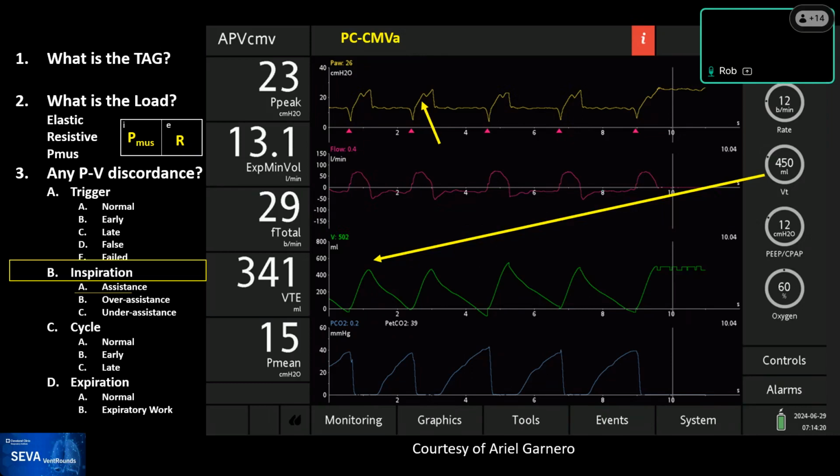And in pressure control, auto peep just decreases the tidal volume and doesn't necessarily affect the plateau pressure, depending on whether or not flow has time to go to zero, like we said at the beginning of this. So these are good observations. I see everybody's thinking hard. And what all this tells you is that pressure control is way more complicated than volume control.